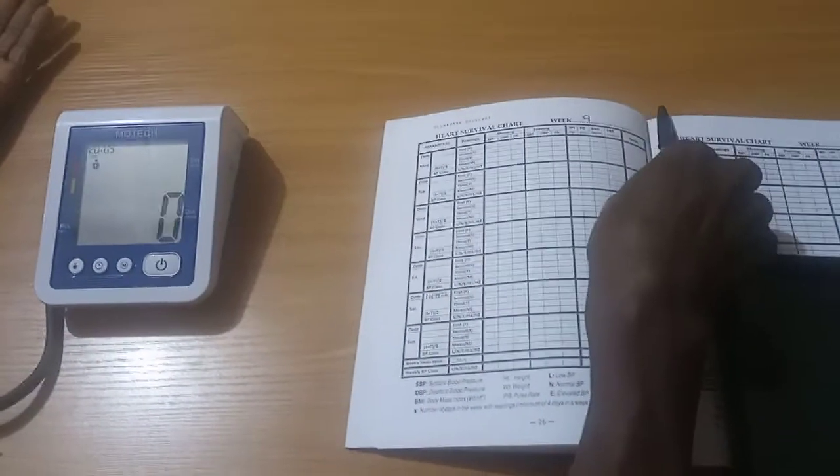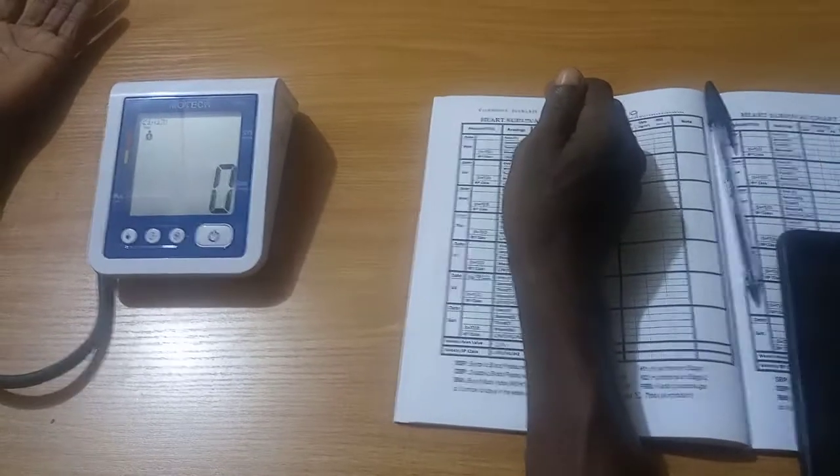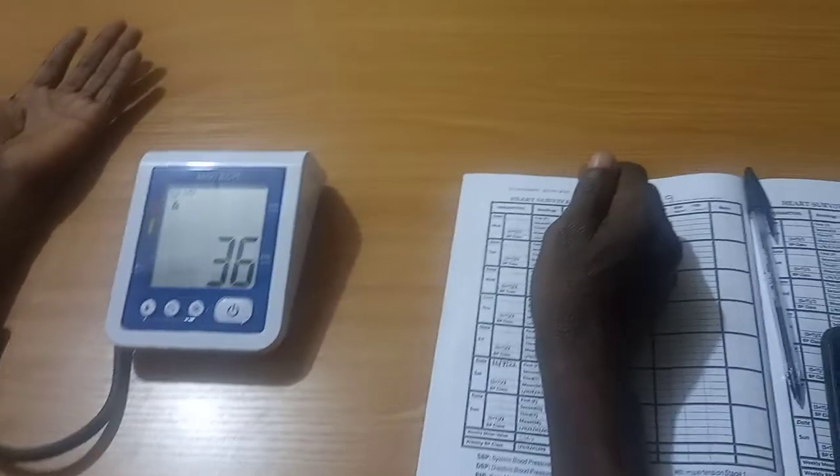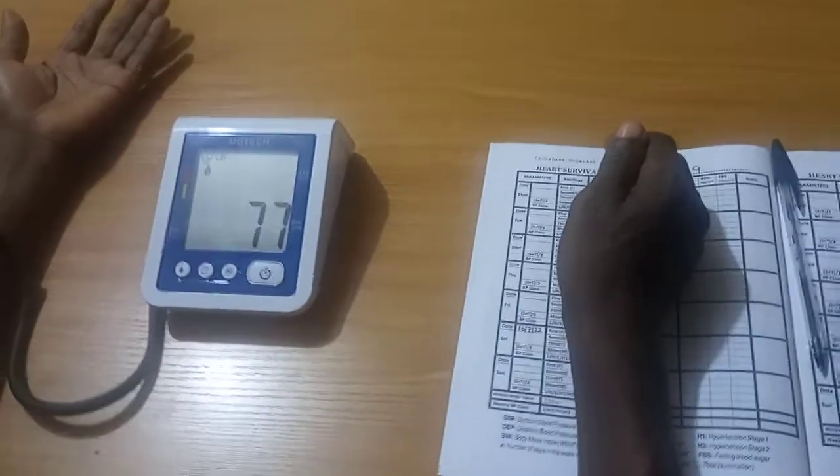When you are ready, turn on the BP monitor and press the start button. The device is ready for use. You may start measuring. Stay still as measurement continues.